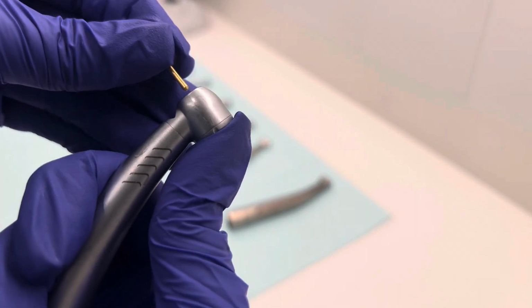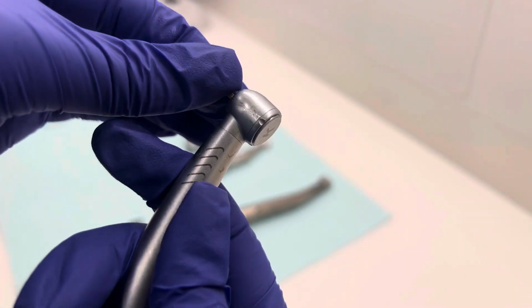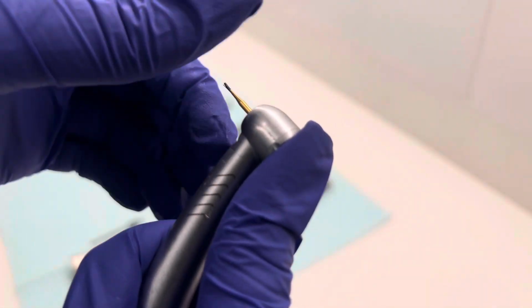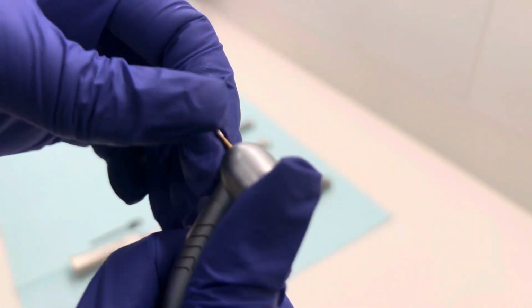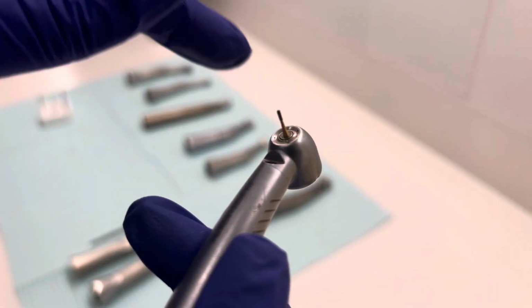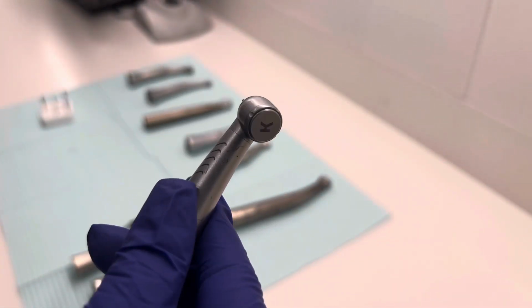Press the back, slide it in. It's as easy as that. You don't have to think about it too much. Press the back, slide it in. Same thing to take it out. You press the back and pull it out. You don't have to think about it too much, as I said. And that's basically what it looks like.